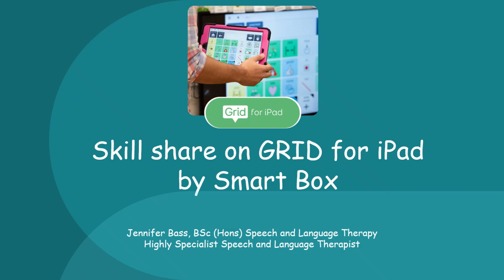This session has been designed for parents and carers of individuals who have been recommended the Grid application, as well as for school staff and other professionals who are supporting communication development.